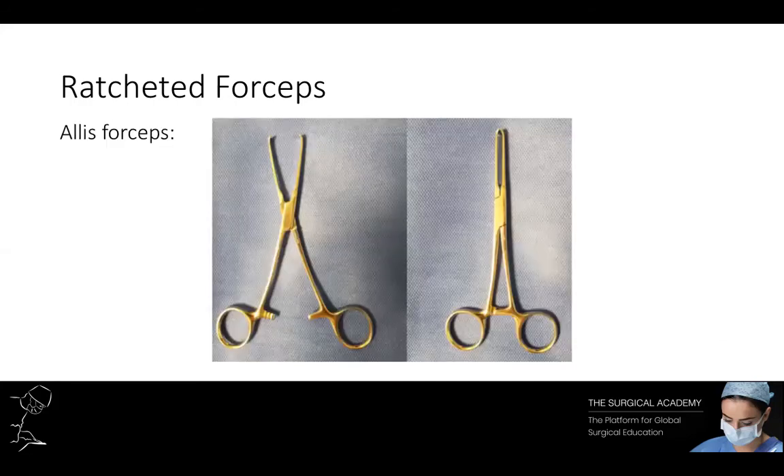This is an example of Allis forceps. As you can see, these are toothed surgical instruments and the presence of these teeth makes them useful when grasping firm tissues such as fascia.